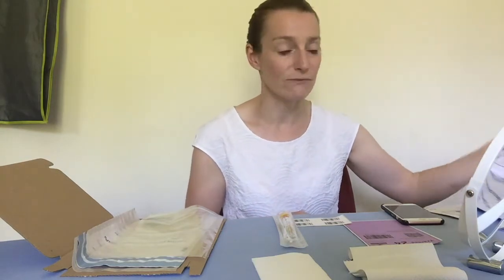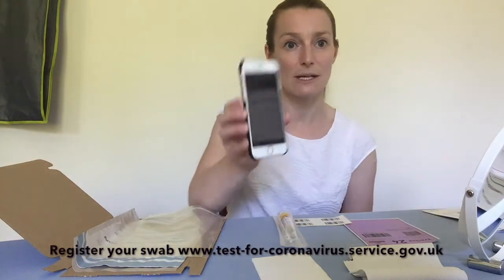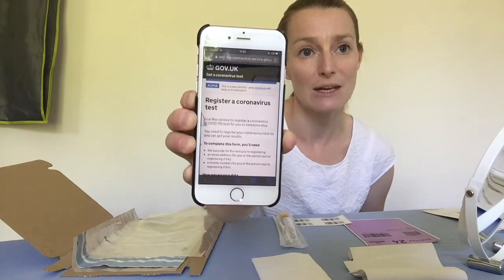The very first thing you need to do in order to take your swab is to register your swab online, so they know who you are when they receive it and they know how to contact you if it's positive. It gives you the website with some questions to answer. Once you've done that, you can then do your swab.